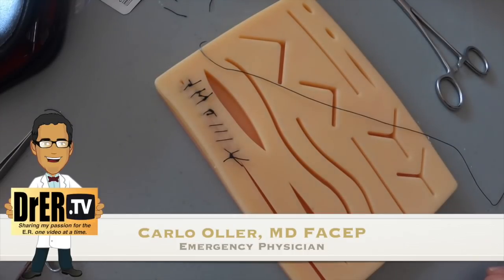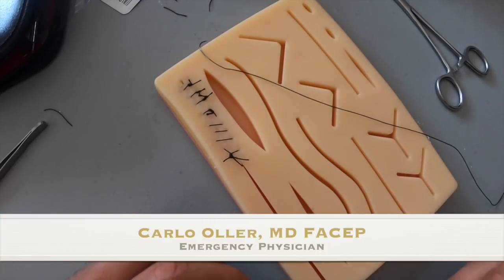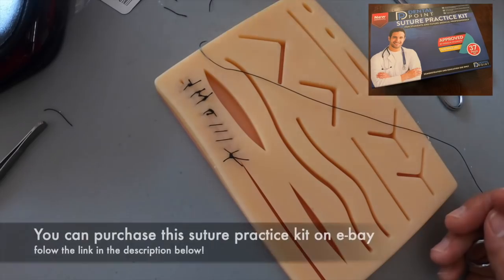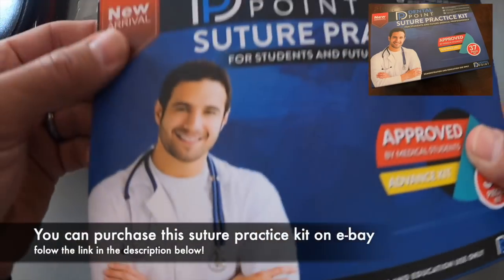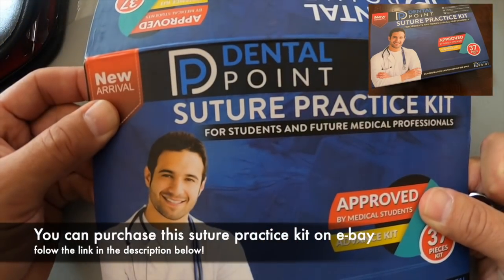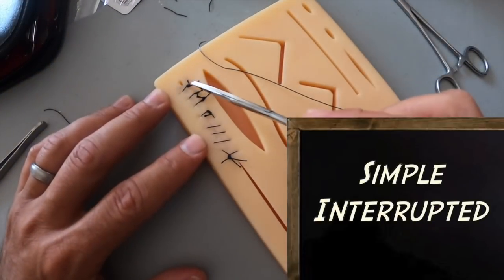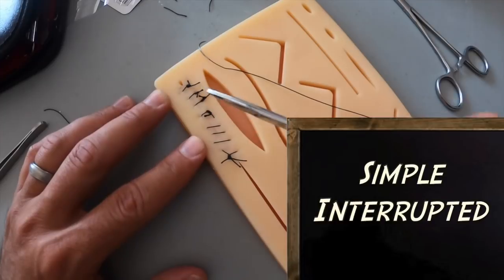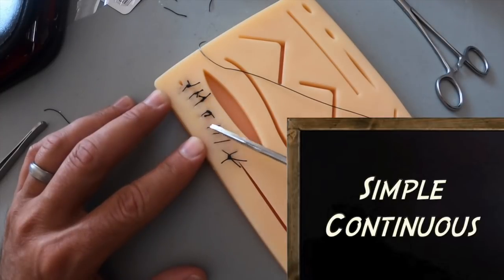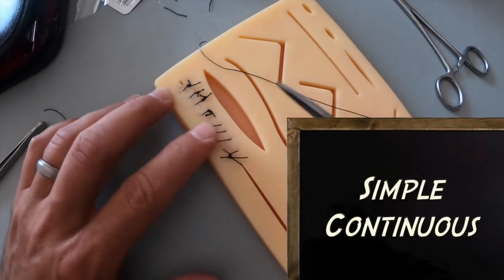Hello everyone and welcome back, this is Dr. Carlo Oller with this laceration repair series of videos using this suture practice kit that you can buy on eBay. We've already done the simple interrupted stitches and the simple continuous stitching.